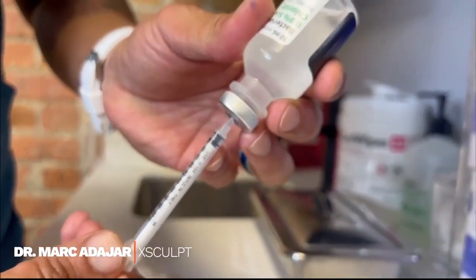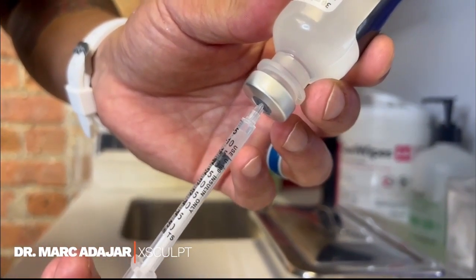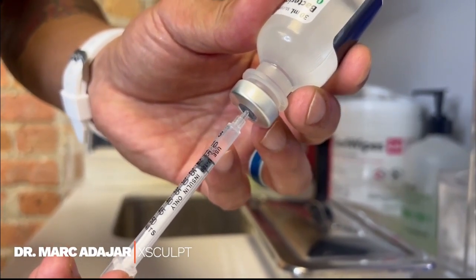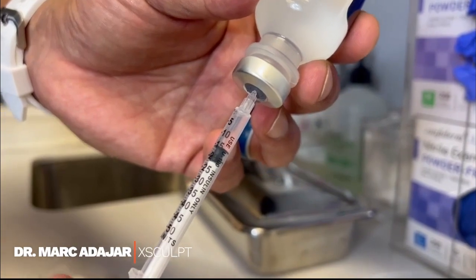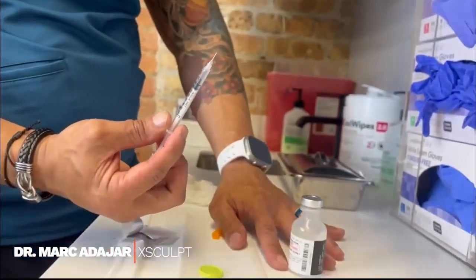Depending upon your dosage, you can see that you're filling it up. Refer to your instructions on how much you are to inject. If you're just starting out, usually for semaglutide it's 10 units and for tirzepatide it's 15 units. You can see I'm at the 15-unit mark here. Then you pull this out and put the vial in the refrigerator.